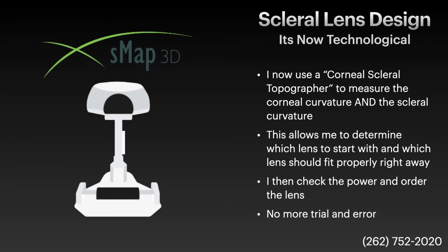Well, now there's a new way to do this, and it's with what's called a corneal scleral topographer. This measures the curvature of the cornea and, more importantly, the curvature of the sclera, the white part of the eye, which the lens rests on.